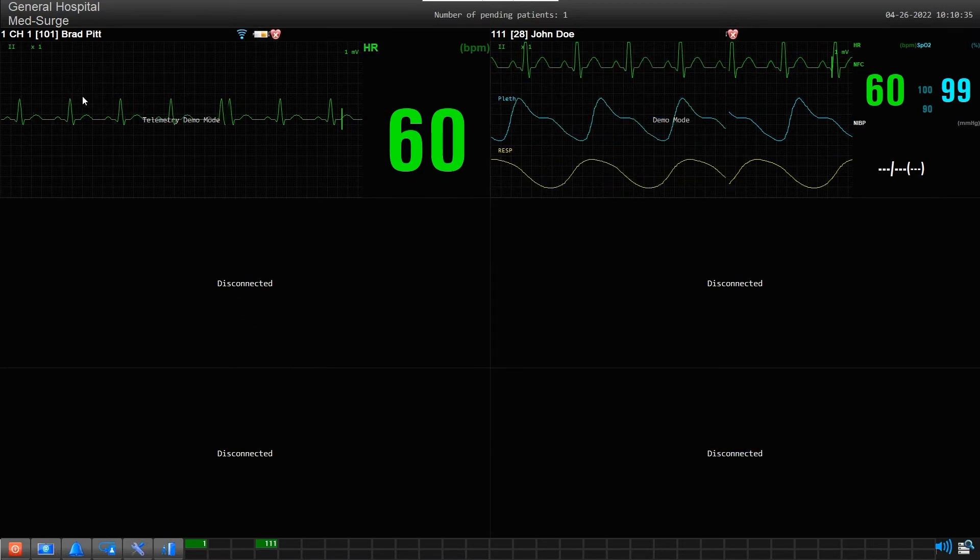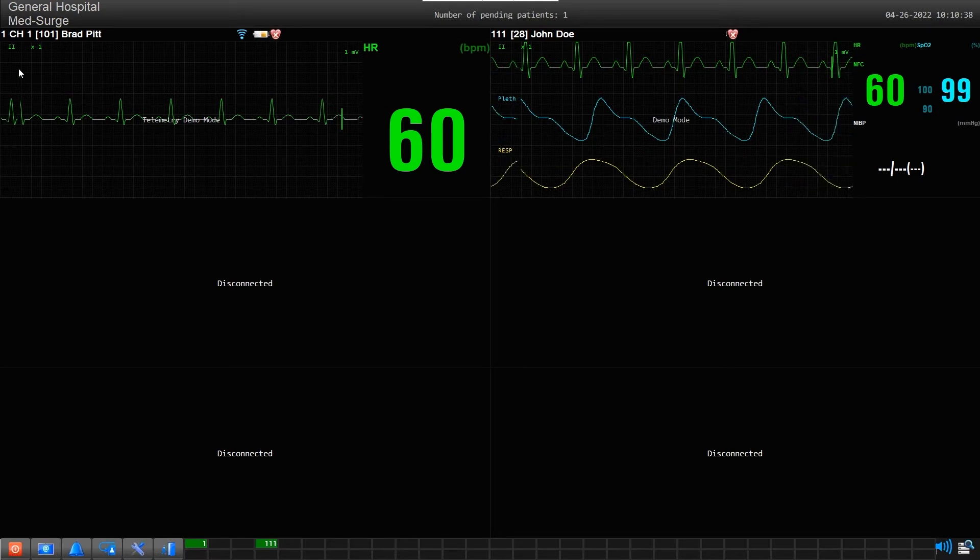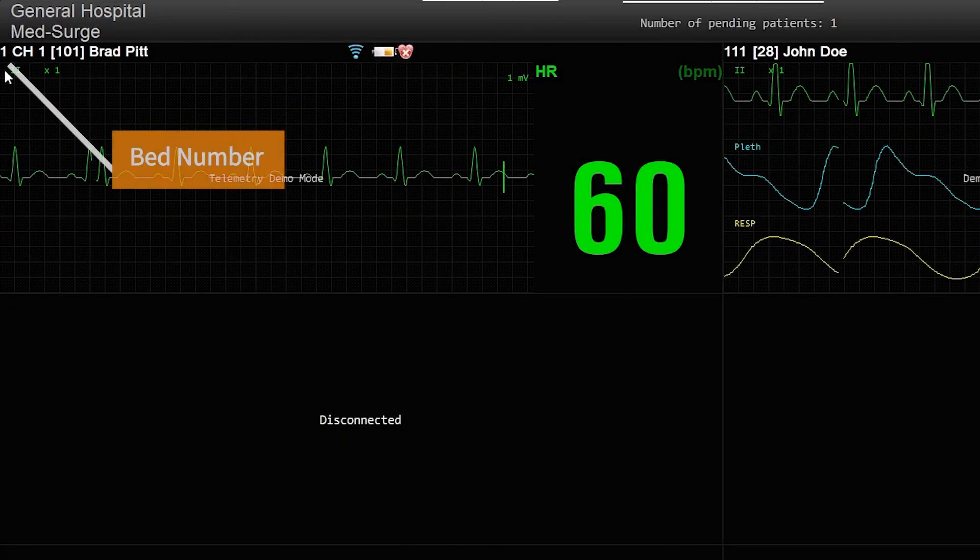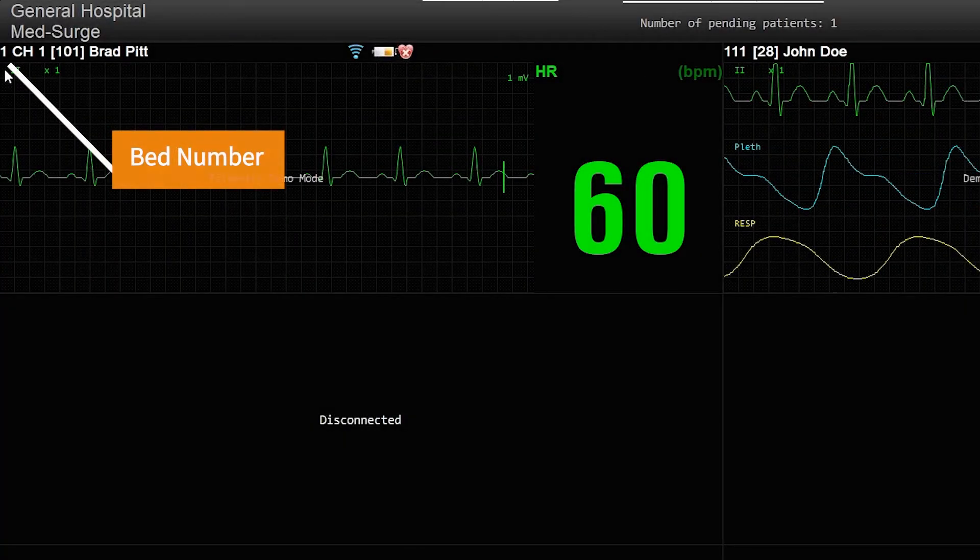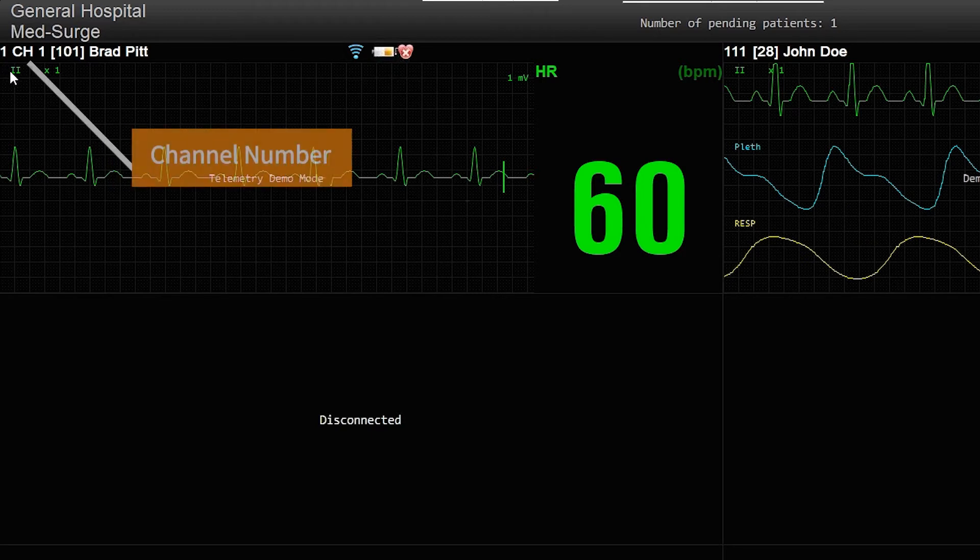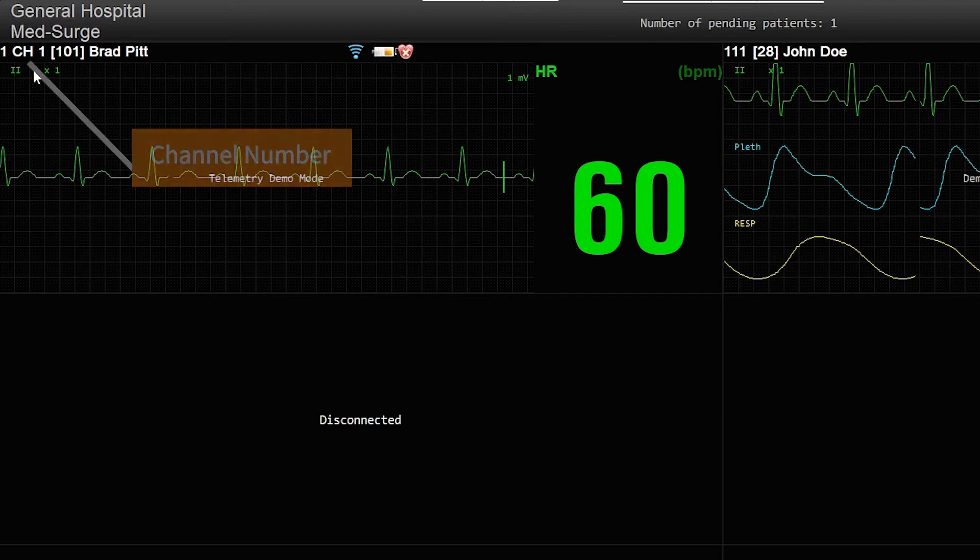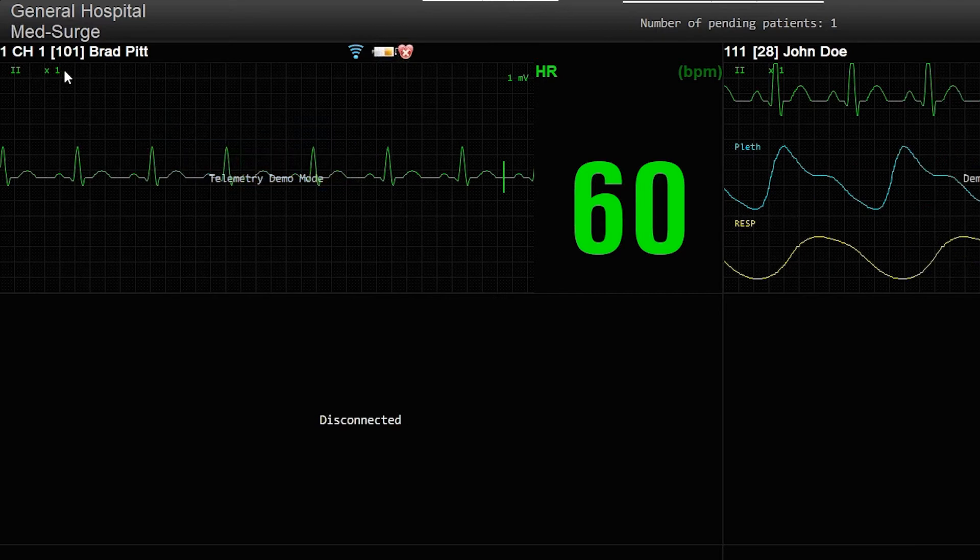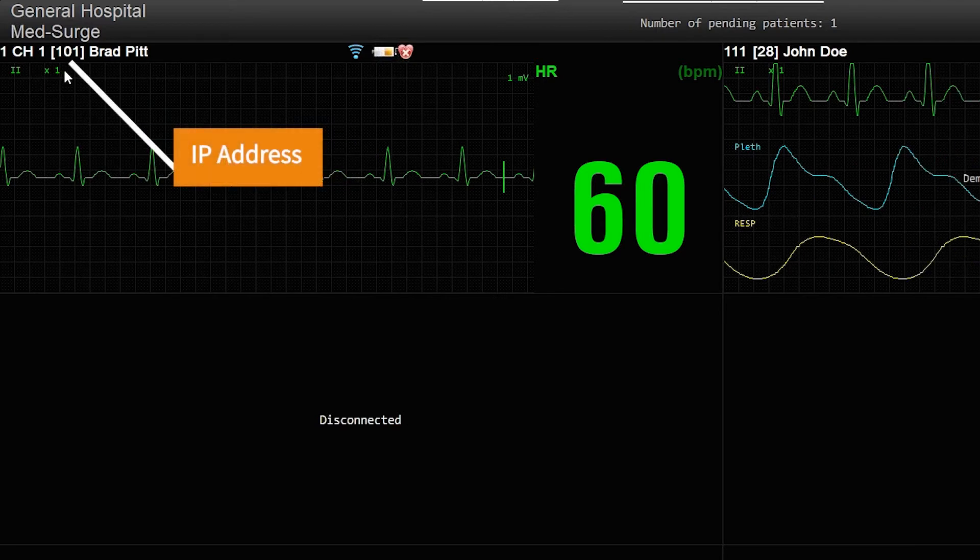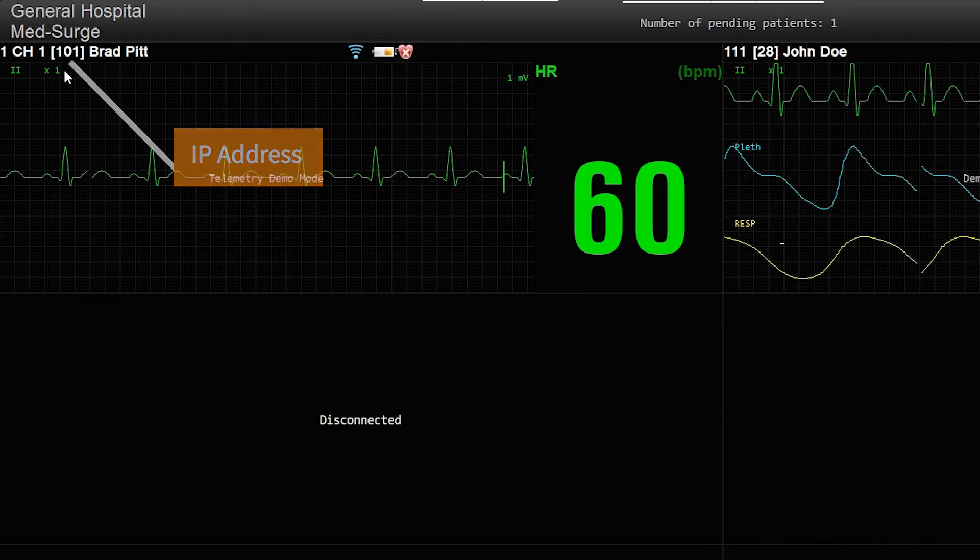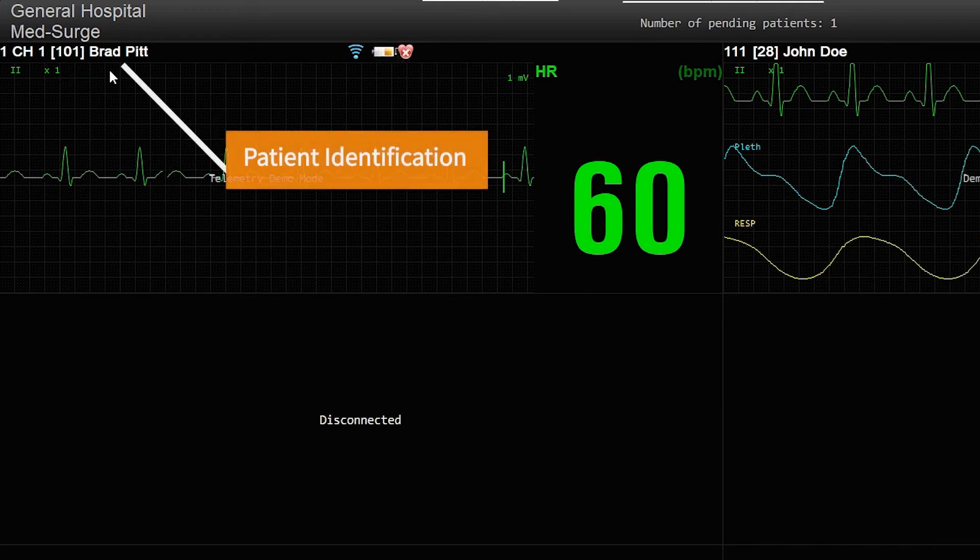A slot with an assigned patient will have bed information assigned to it, like this one. This first number is the assigned bed number, and this number is the channel number of the device. CH stands for channel number. Any number in brackets like this one is the last octet of the device's IP address, followed by the patient's name or ID number.